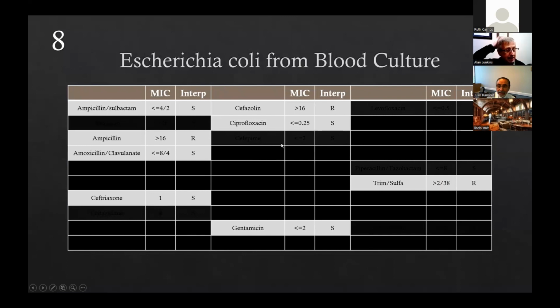So selective reporting is really, really important. A lot of facilities don't do a great job at this. It's not required from an accreditation standpoint for laboratories, except for site-specific, source-specific selective reporting, but it is a really important thing for laboratories to do.